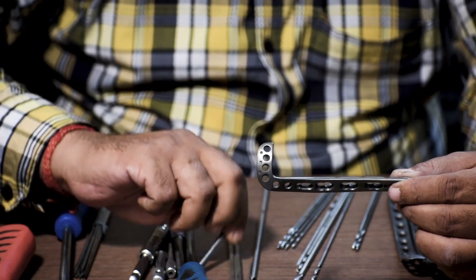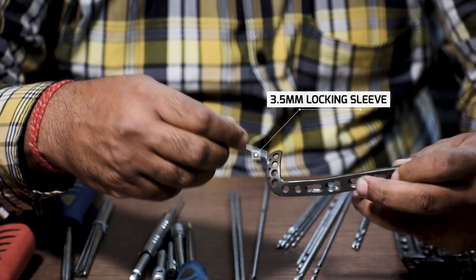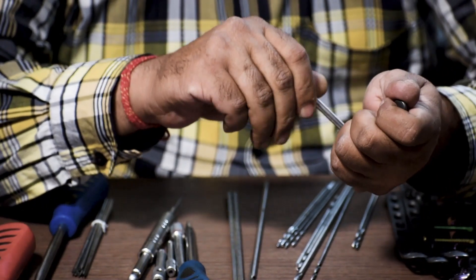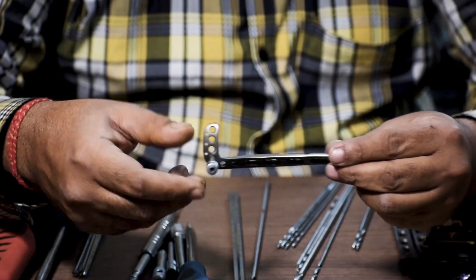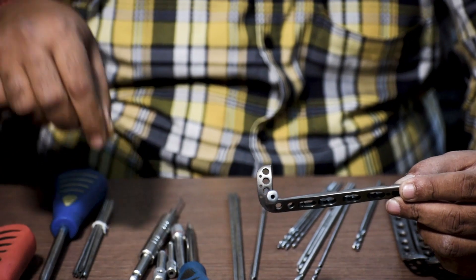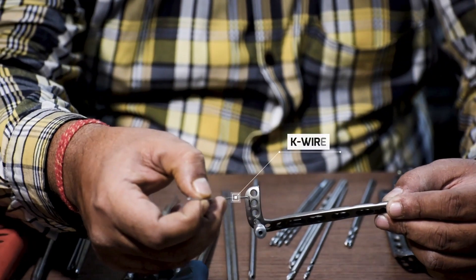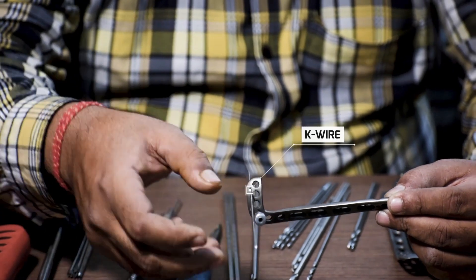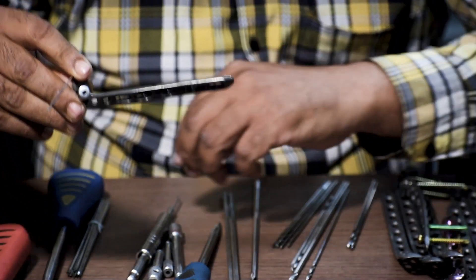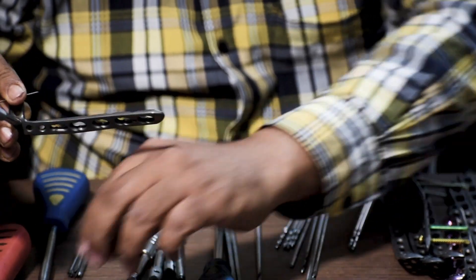After this we use a 3.5 mm locking sleeve and attach it in the distal part of the plate. After this process, the plate is placed on the fracture site. Then we attach a K-wire in this small hole to provide plate stability and reduce any further movement of the plate from the fracture site. This also ensures reduction of the plate.